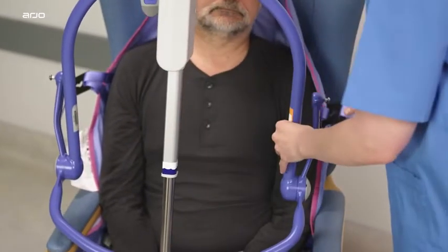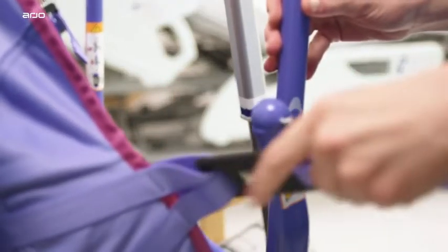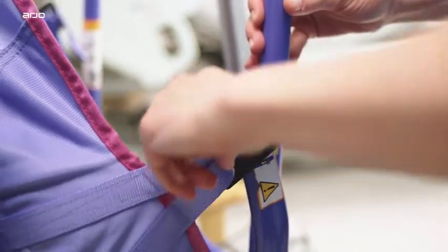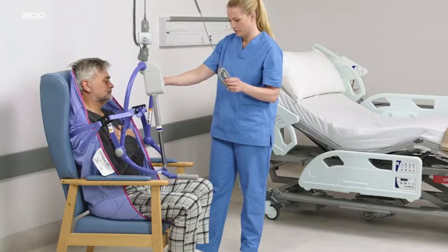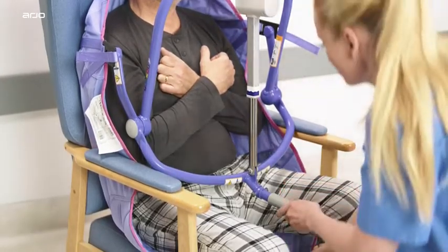Once the PDPS is in position, attach the shoulder strap attachment clips to the sling attachment lugs on the spreader bar. Using the hand control, lower the PDPS and attach the leg strap attachment clips.